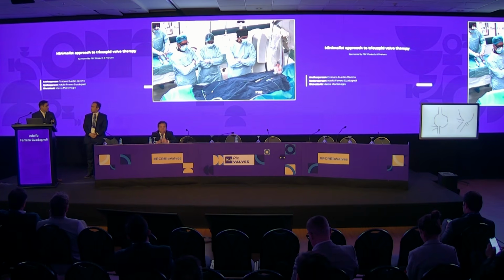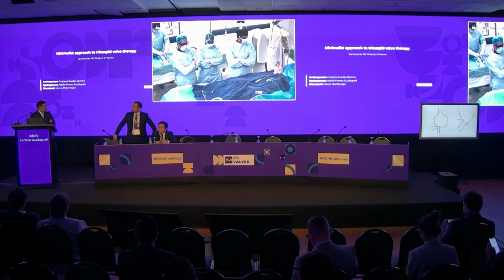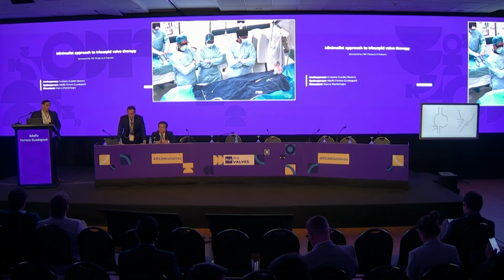But why did you analyze going with a heterotopic implant? What are your thoughts about that? We followed somehow the algorithm that you showed. TEER was impossible. The valve was deformed because of the pacemaker, and also it has a repair. And the degree of coaptation, the degree of disease of the leaflet was tremendous.